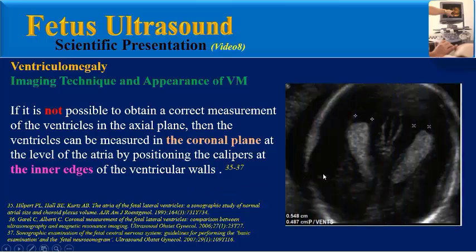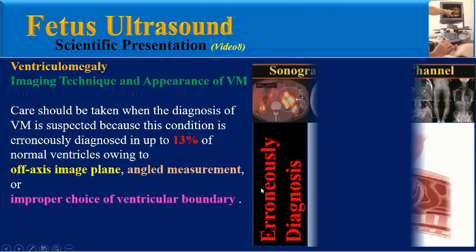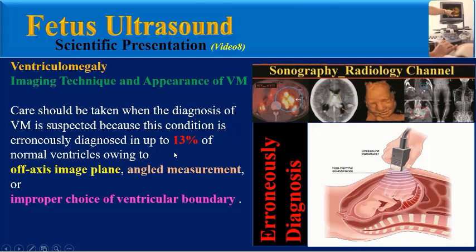The dangling choroid plexus sign refers to the downward position of the choroid plexus toward the gravity-dependent wall in an enlarged lateral ventricle atrium. Detection of this sign, or when the glomus fills less than 60% of the atrium, should prompt careful evaluation and correct measurement in the axial plane. Care should be taken as ventriculomegaly is erroneously diagnosed in up to 13% of normal ventricles due to off-axis imaging, angled measurement, or improper choice of ventricular boundary.